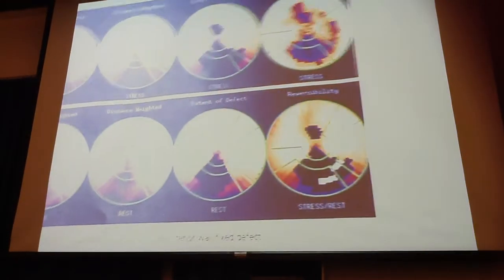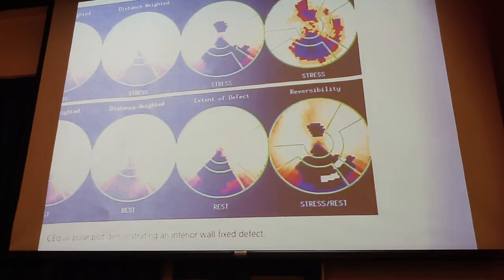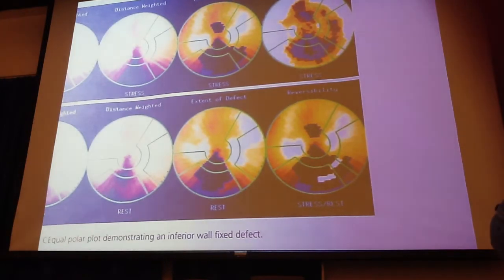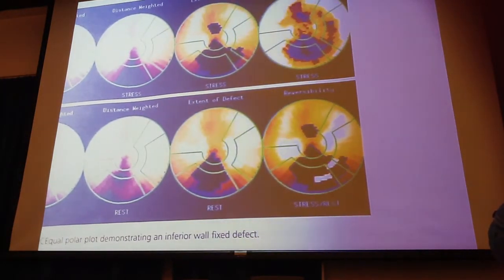How do you tell? Negative means that there's an absence of activity. Positive means that there's an increase in activity. If there's an absence of activity, then it's a negative infarct imaging agent, because it's showing that there's no blood flow or no activity in that area.